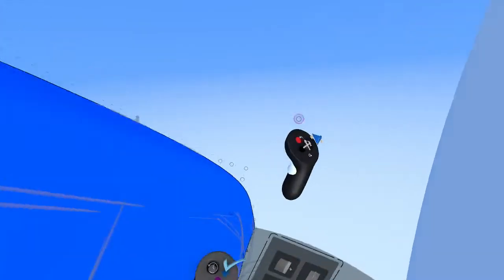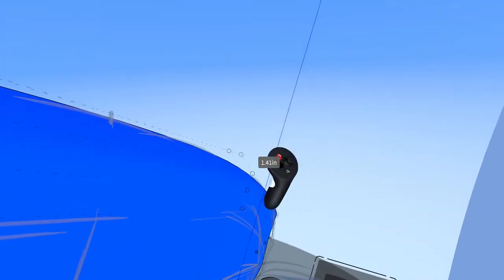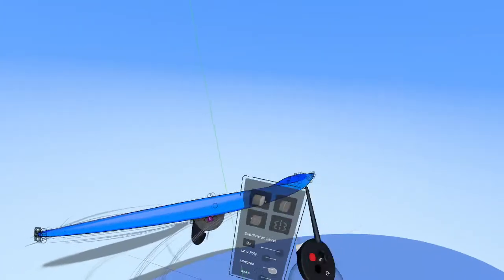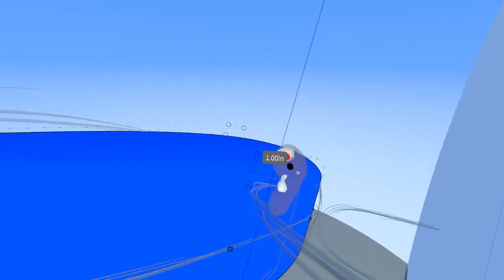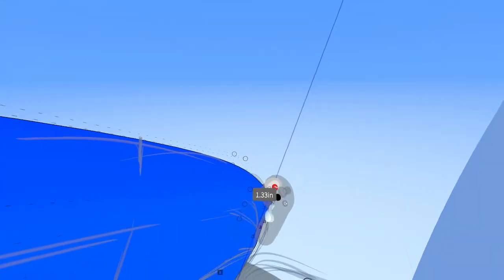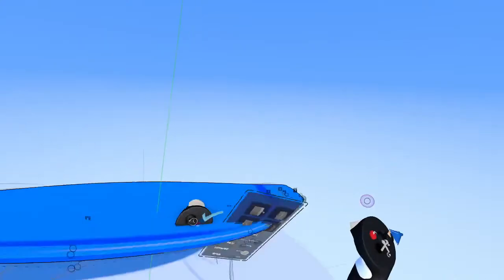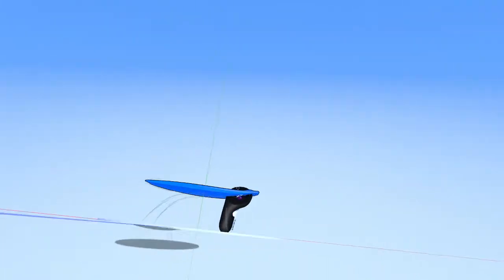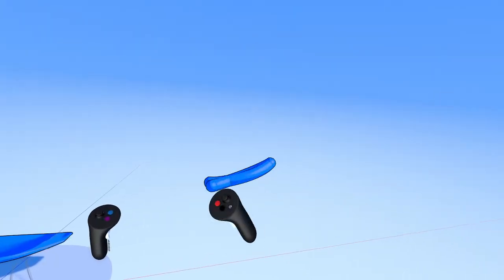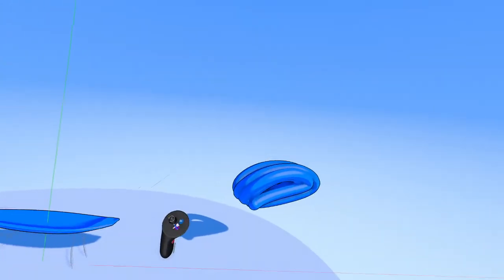You'll see that I'm using Smart Move also here to start moving around edit points in a very exact fashion. So for instance, under here, I'm using Smart Move to move them along the Z-axis here. And so if you haven't used Smart Move before, I'll just demonstrate that real quick here, just make some scrap geometry.